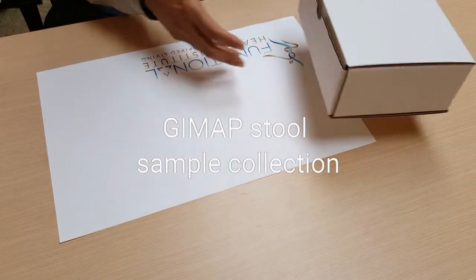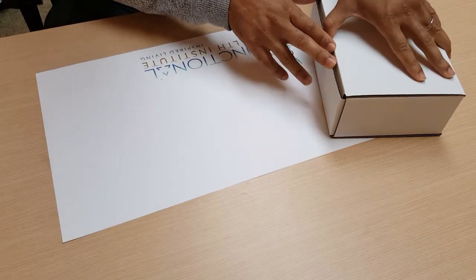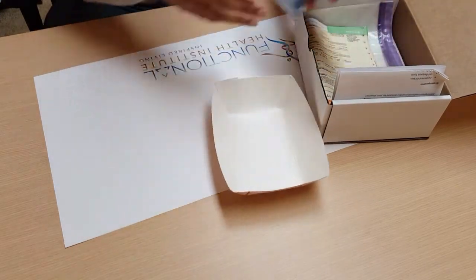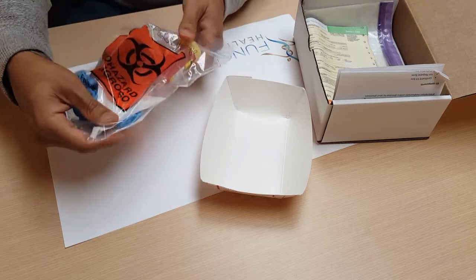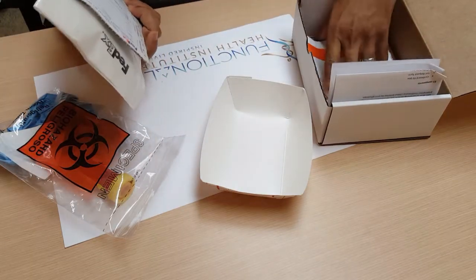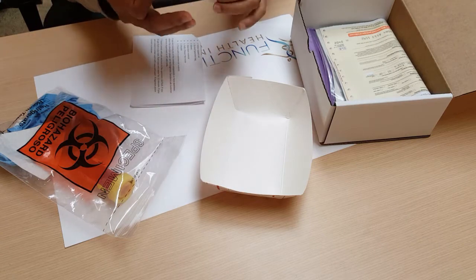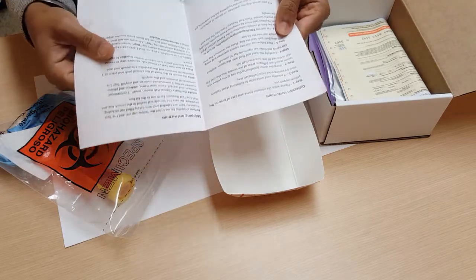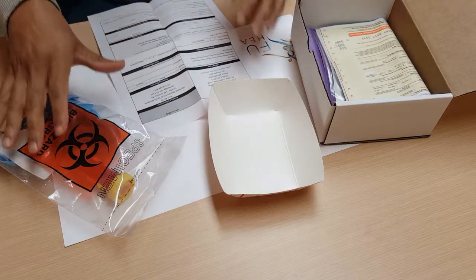This is what their box looks like. Whenever you're starting to make any type of lab collection, you want to familiarize yourself with what's inside the box. When you open this box, you'll find a paper tray, a bag that has a yellow vial in it with red solution, two rubber gloves, and an absorbent pad. You also have shipping information — the shipping is prepaid — along with FedEx shipping materials and two very important pieces of paper: your lab requisition form and the actual instructions.